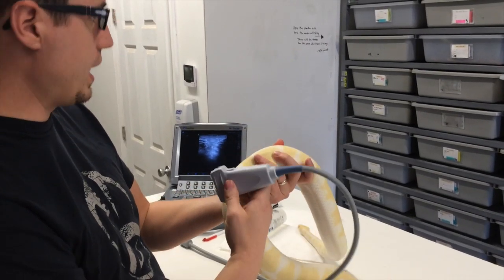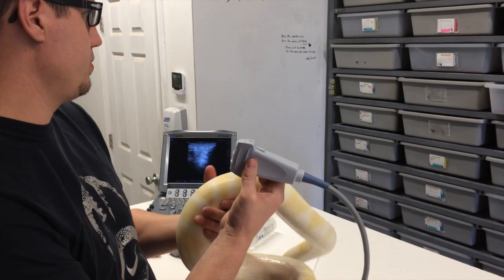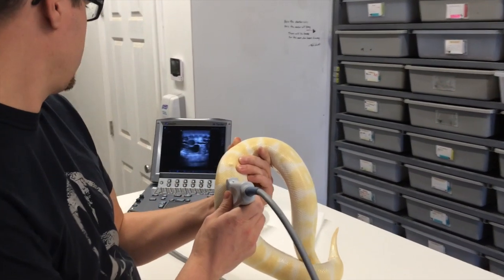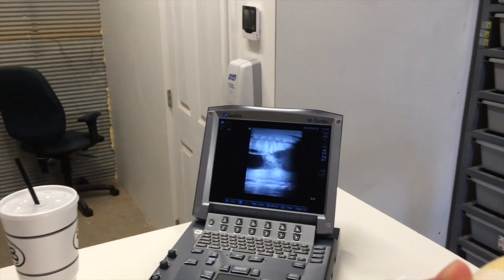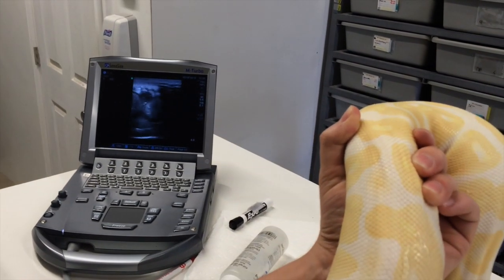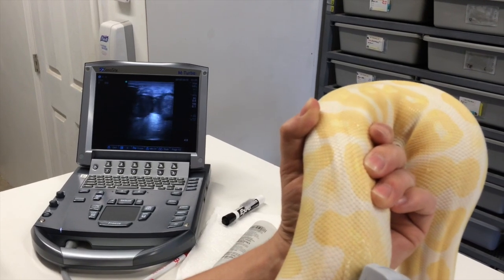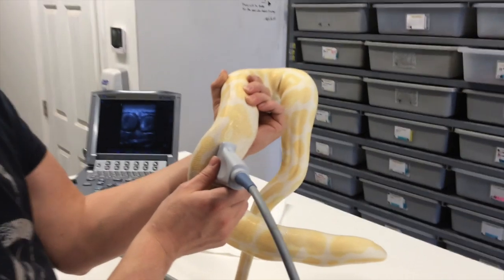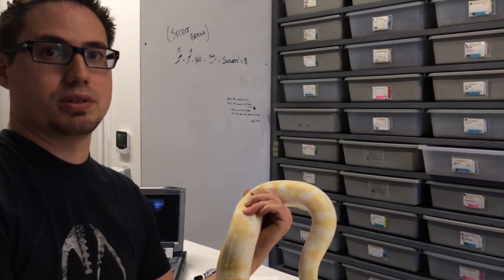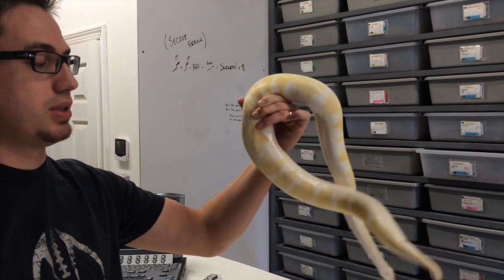Here we have an albino — last time she had 1.0 centimeter follicles and was bred about a month ago for the first time to a leopard piebald. This can make leopard double het albino pies, which would be really cool. Now, a month later, we've got some small residuals up here, but coming down they're getting really big — up to 2.0 or maybe even slightly larger. She's definitely in growth mode. I probably won't even put another breeding on her — she should be good until she ovulates. There's no real time schedule; you just follow follicular development, catch that ovulation, and then you have 50 days until they lay.